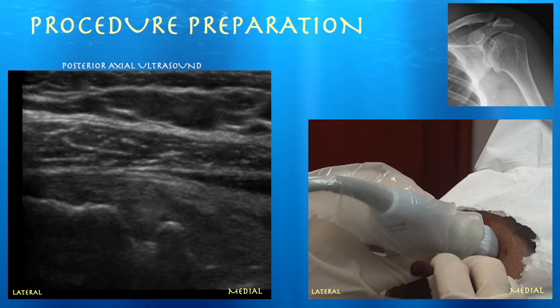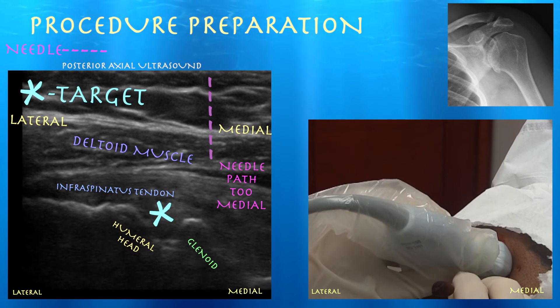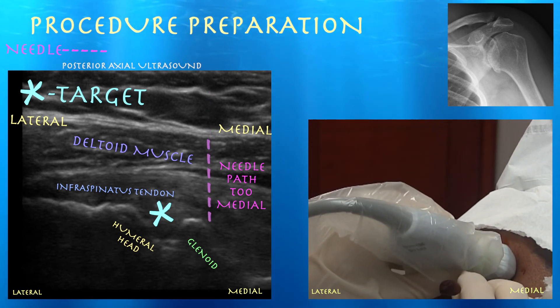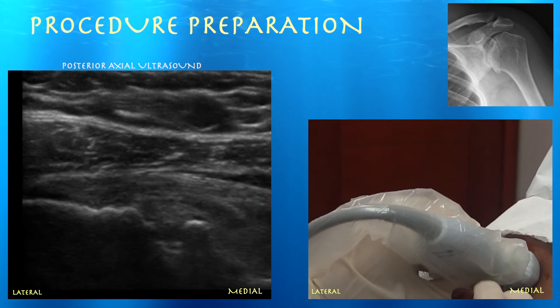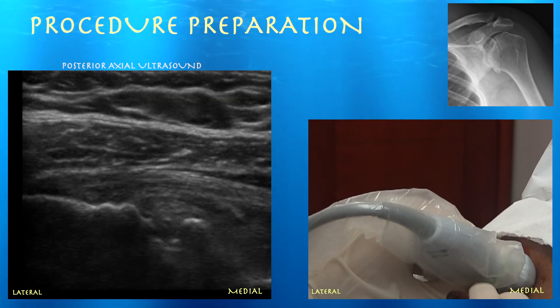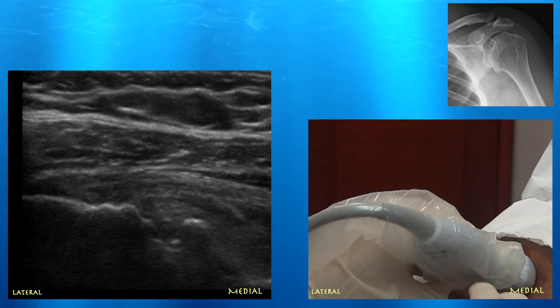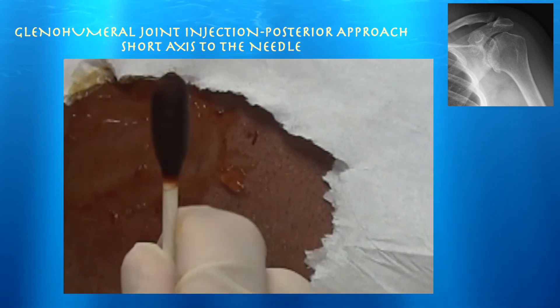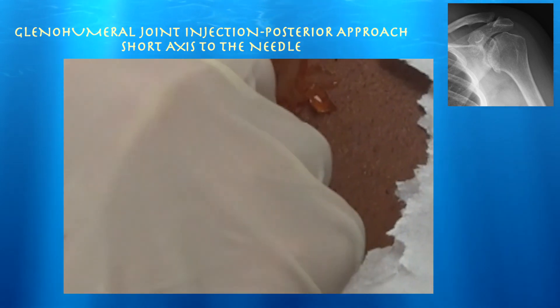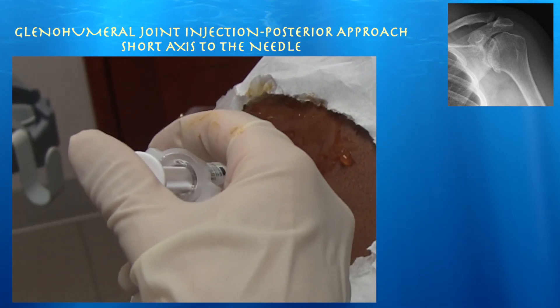If I push and drop a straight line from there, I'm going to be a little bit too medial — medial to the glenoid. The muscle layers we're looking at right now are basically just deltoid muscle. It looks like I'm basically right over that joint, maybe a touch lateral, but essentially within the joint where you want to go. We're just talking millimeters difference between too medial and just right. I've got three dots to choose from; I'm going to go for the one all the way on the left. What I like about this approach is it's just a straight shot — you don't need a long needle, it's a direct approach right into the joint. I aim it a little bit toward the coracoid, the way people inject without ultrasound.